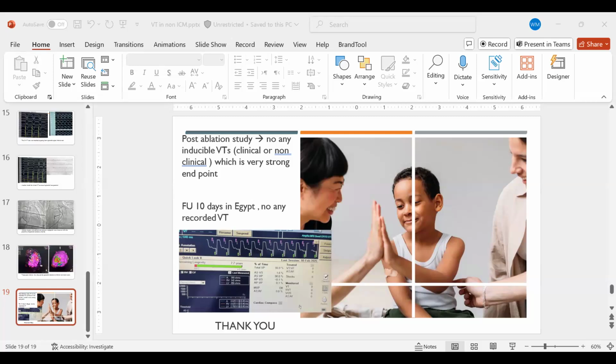Okay, great. Dr. Ashley Shin, do you have any comment before our closure? We also have Dr. David Bradley on board. Oh, great. No, it's a very good case. When you mapped the epicardium, I know you did a nice pace map and you matched close to 12 out of 12. Did you do entrainment mapping as well, or did you just go for the exit sites? No, we did not do entrainment because the tachycardia was unmappable due to hemodynamic compromise. So we just depended on the late potential mapping and the perfect pace match at the exit site.